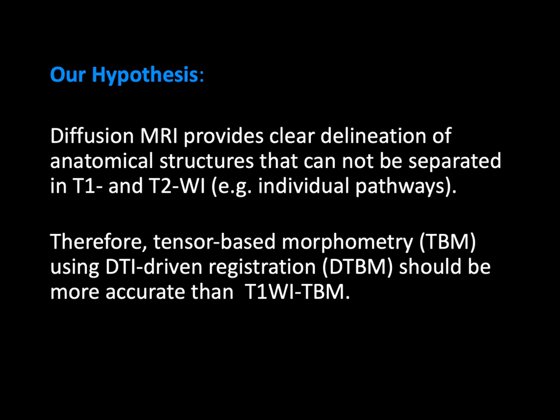And again, we didn't have any introduction to diffusion MRI this year. I think the organizers encourage people to go and study the previous courses and so on. But as you probably know, diffusion MRI provides additional information, in particular in white matter. So we are able to identify, based on their orientation, based on their anisotropy, within a region that would appear homogeneous in T1-weighted images, individual bundles of white matter.